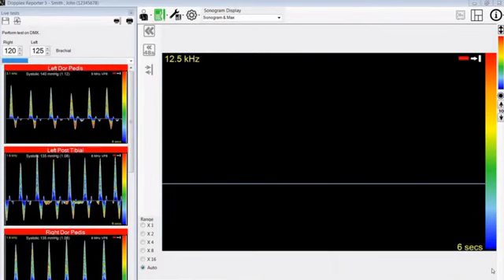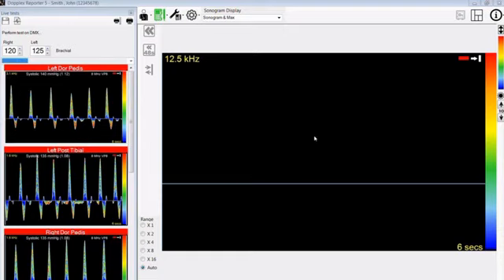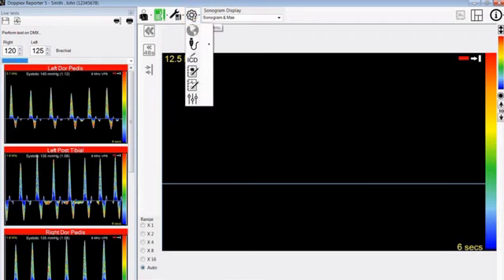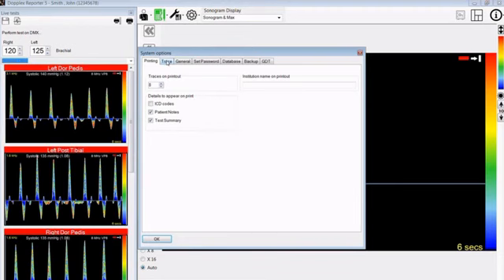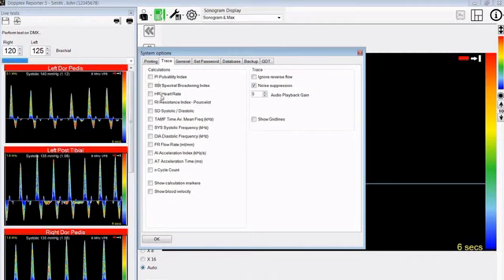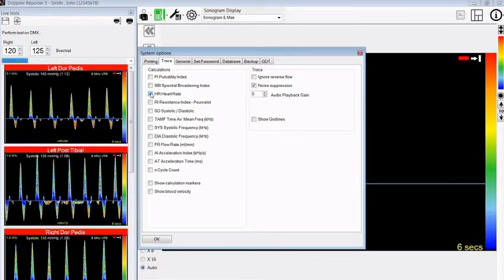Here we can demonstrate the Doppler calculations and how they can be enabled. The Doppler calculations are available in version 5.1 of the software. To select the calculations, go to the settings menu and then go to system options. Select the trace tab and you have a list of the calculations that are integral in the 5.1 software version. For instance, we can select heart rate and on this type of waveform, pulsatility index. As you can see, we can calculate a number of parameters here.